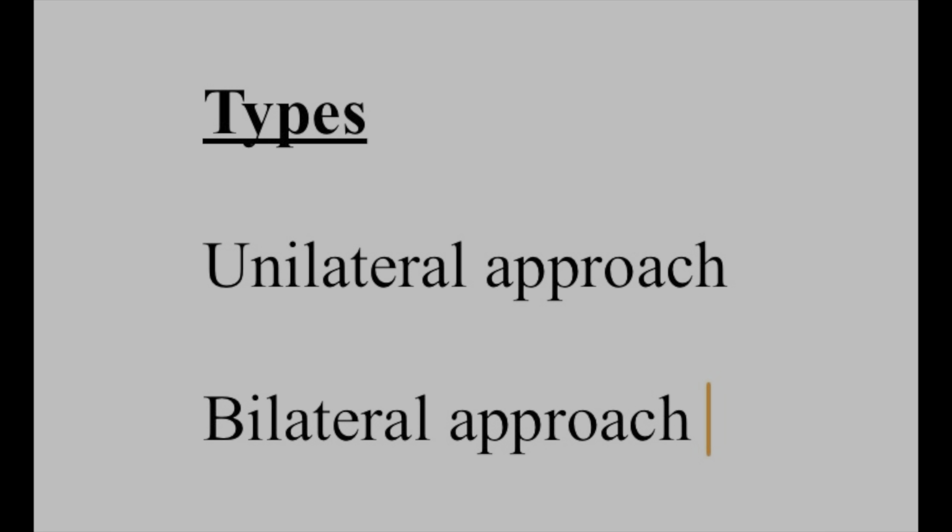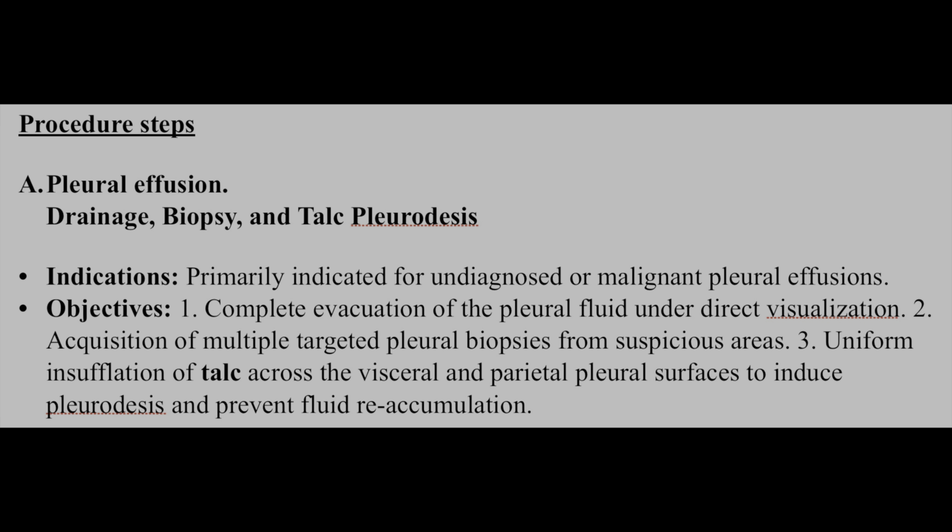Types of approaches that can be utilized in VATS are the unilateral approach and the bilateral approach as per the procedure demand. Procedure steps in pleural effusion: drainage, biopsy and talc pleurodesis is done.